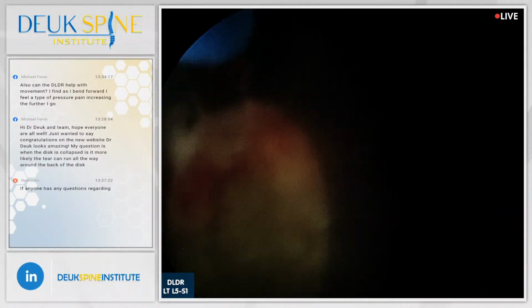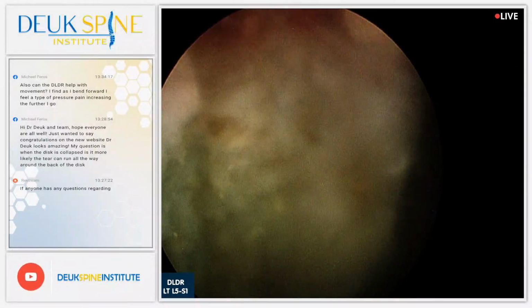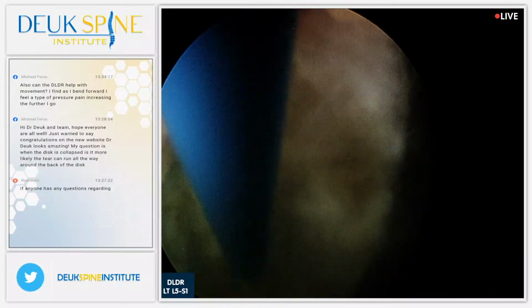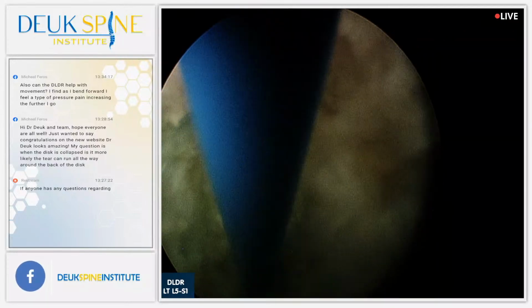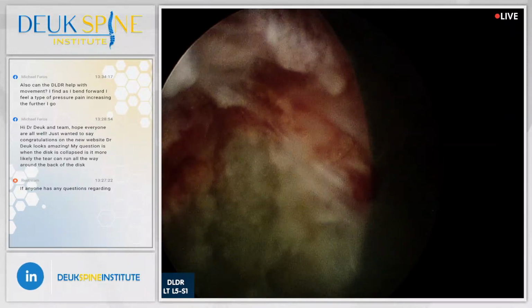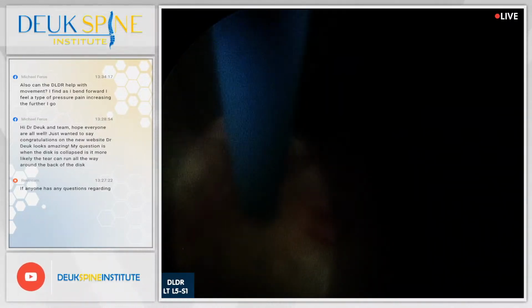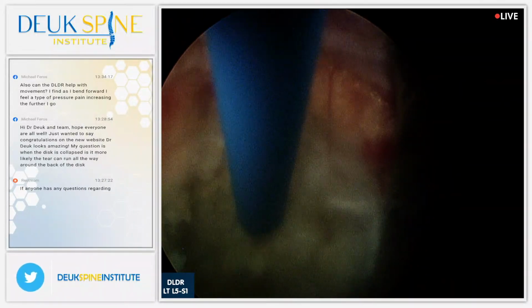By the way, he's kind of a younger guy. I'm not going to give you his age, but he is younger. And that works to his advantage. I'll tell you why. What limits my ability in transforaminal lumbar surgery to get medially towards the midline is the facet joint. And the facet joint is, in his case, quite normal. So because of that, I can get more medial than somebody who's older. Like right here, being able to see this like I can right now at 12 o'clock, that's amazing, you know? I wouldn't be able to do that in somebody with big facets. Somebody who's like 70, 80 years old, I wouldn't be able to do this right here.